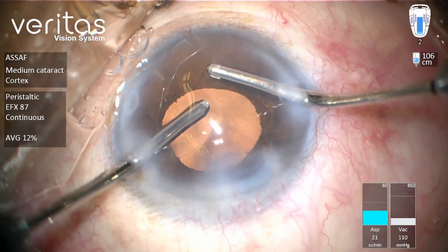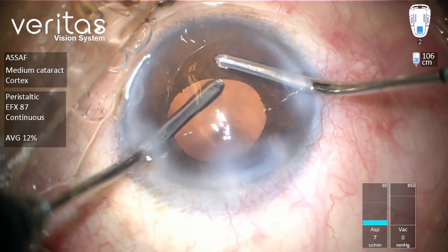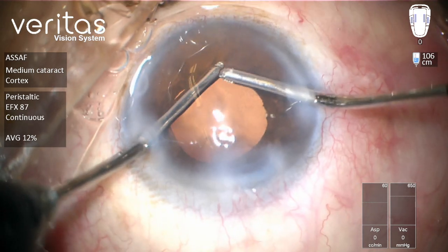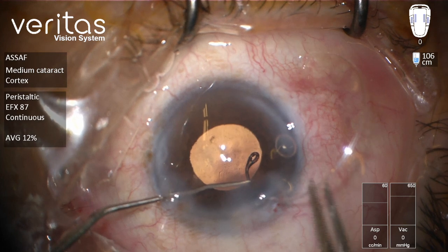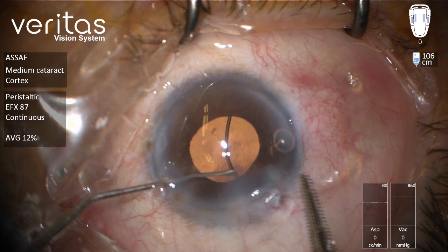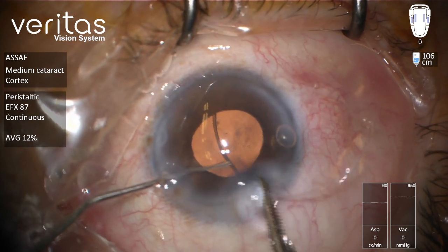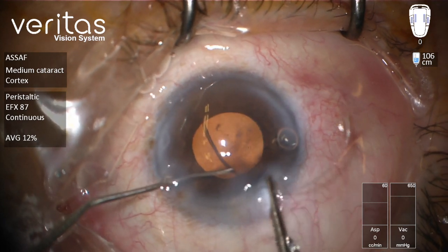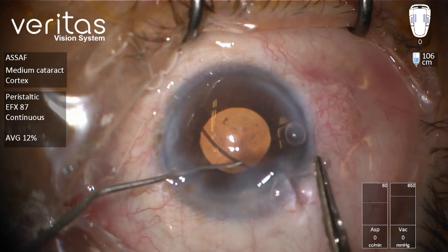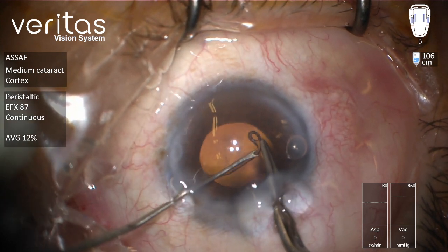As you can see, this is the vent function of the machine — once you release pressure on the foot pedal, the machine performs an automatic reflux. We are now introducing the capsule tension ring inside the eye because there is generalized zonular weakness with this hypermature cataract, which will facilitate management of potential displacement or dislocation of the IOL-capsule complex in the future.